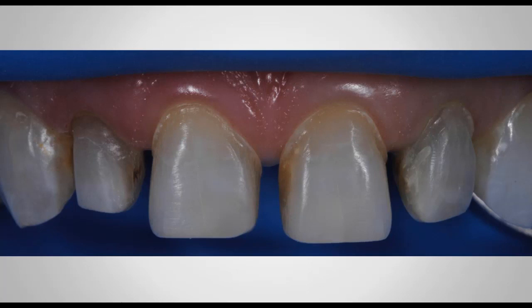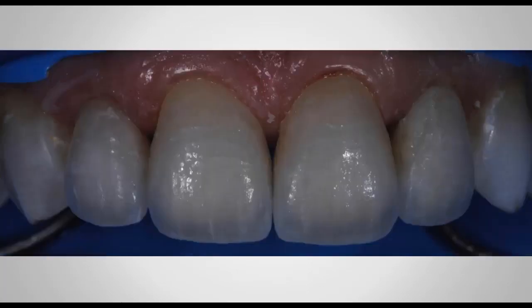And what I like about the try-in paste is that you have only three options. You normally are going to use the clear option. This is the option that I use here. But sometimes you have one of these cases where you need a lighter shade. You need to highlight a little bit the value of your veneer, and you maybe use a white cement. And what I like about the white cement on Nexus or NX3 compared to other brands is that it's not that frosty white, and not like the opaque white that, when you have a thin veneer, you'll see through your veneer, that very intense white. This has more of a natural looking tooth color white that really blends in, and I personally like it a lot.